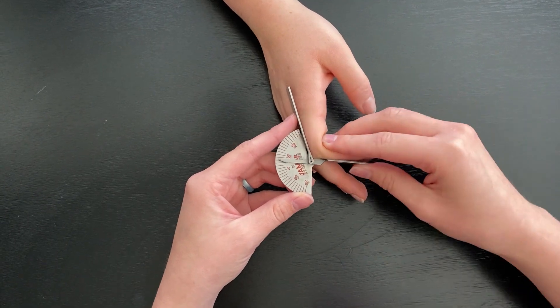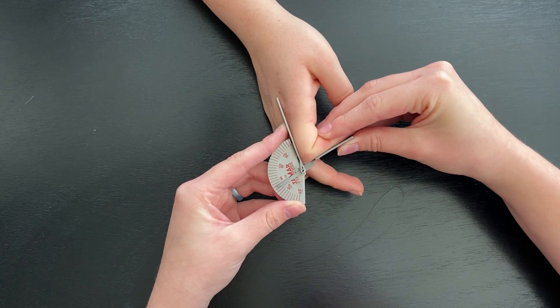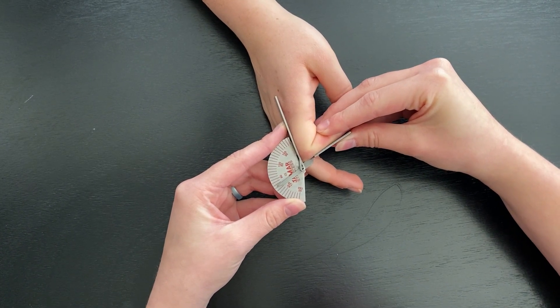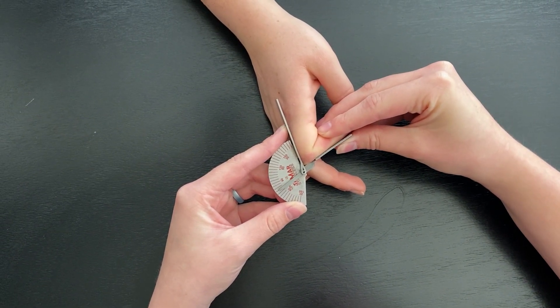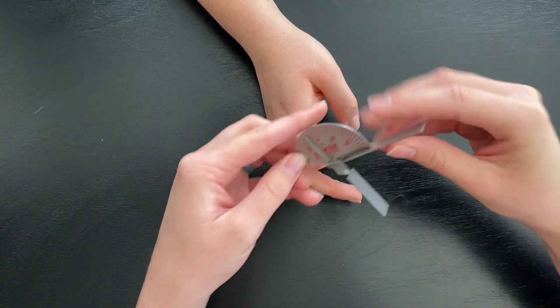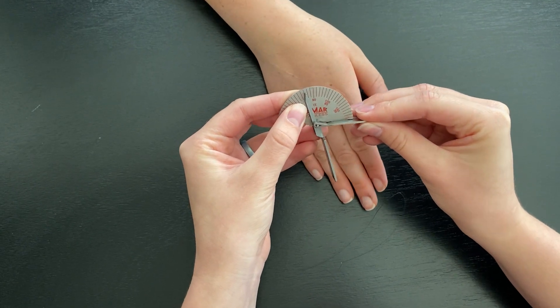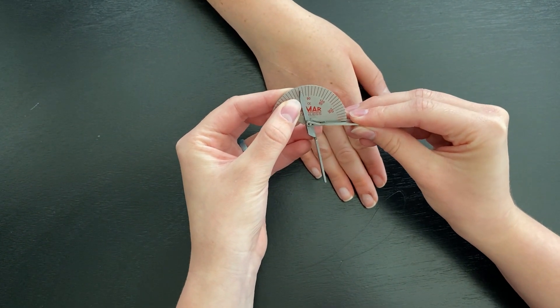We're going to move her finger into PIP flexion. She is at — looks like 103 degrees.